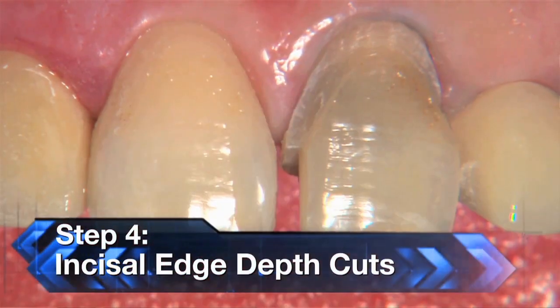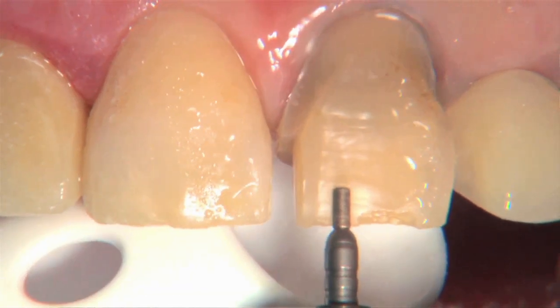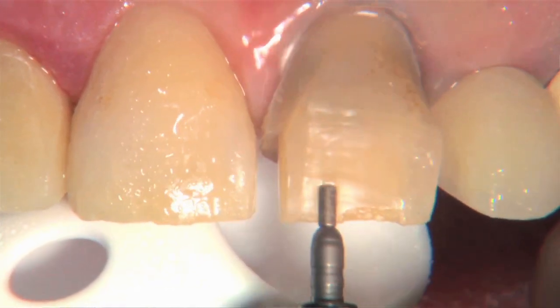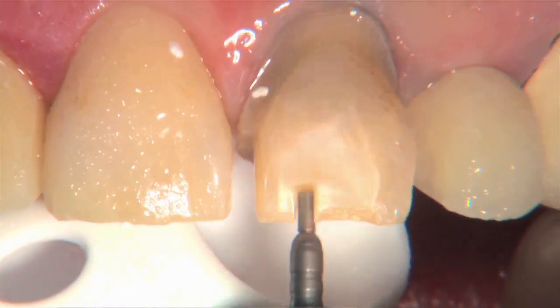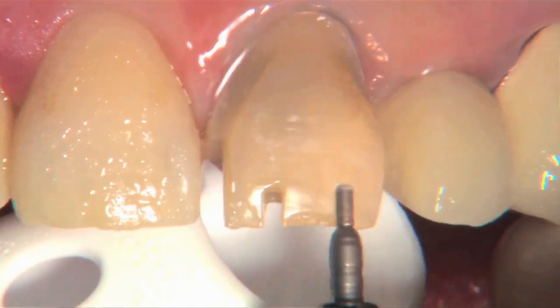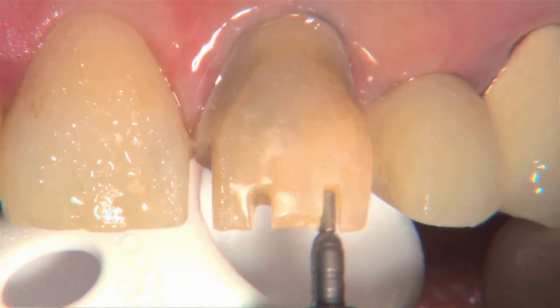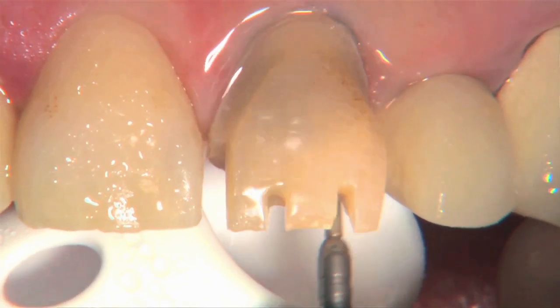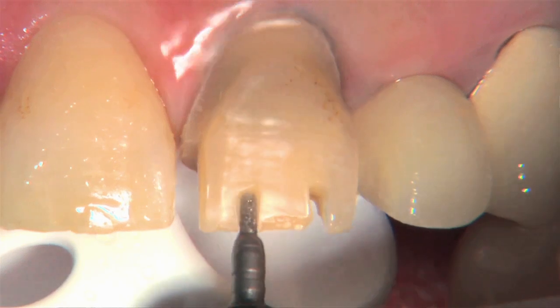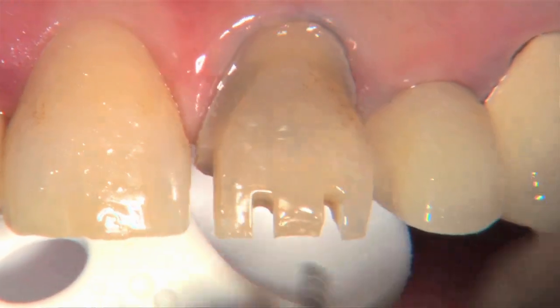The next step in this technique is the incisal edge depth cut. And even though this is going to be a bruxer crown, I'm prepping it as a universal preparation, as though this were going to be E.max. So I'm doing a 2 millimeter depth cut in the incisal edge. I said earlier depth cuts for E.max can be at 1.5 millimeters, but if we're going to cut back and layer it, like most dentists like on anterior teeth, 2 millimeters is fantastic to give your technician plenty of room to give you a great looking E.max crown.